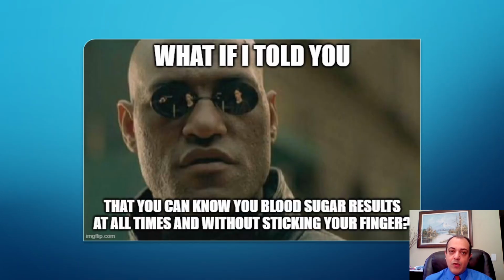I'm sure that you've all heard about the glucose monitors or the glucose sensors or continuous glucose monitoring systems. All these are names used to describe devices that check the blood sugar in real time at all times and that are used instead of having to suffer the pain of finger stick. And so they help us guide the treatment of diabetes.